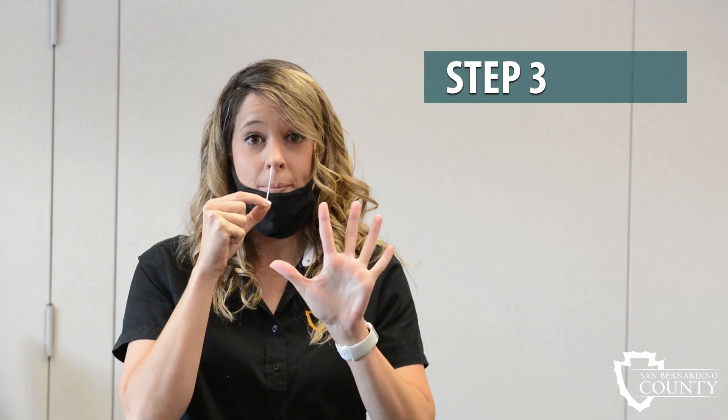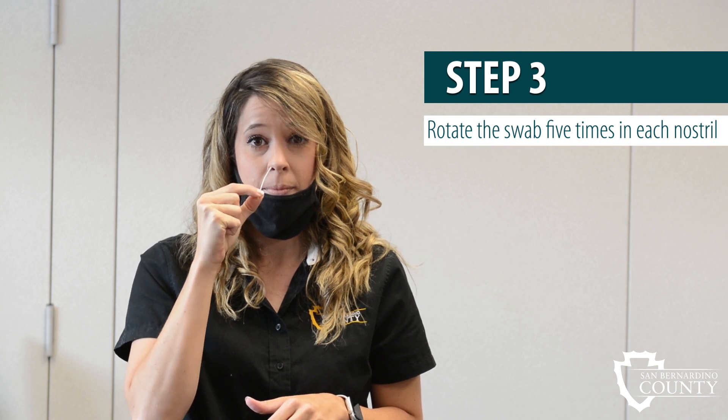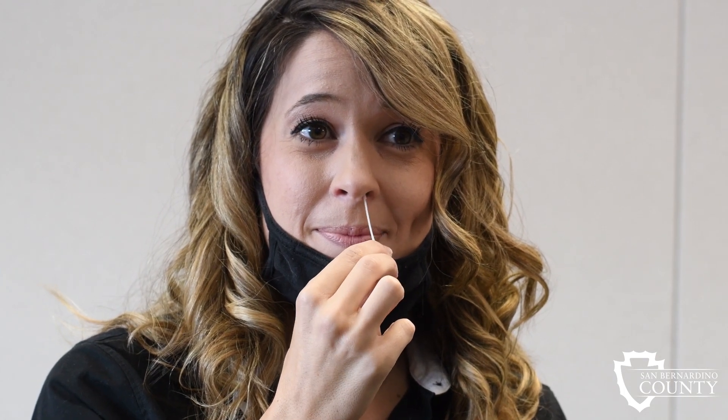Step 3: Rotate the swab five times, touching all sides of the inside of your nose. Then take the swab out and repeat in the other nostril, rotating the swab five times.